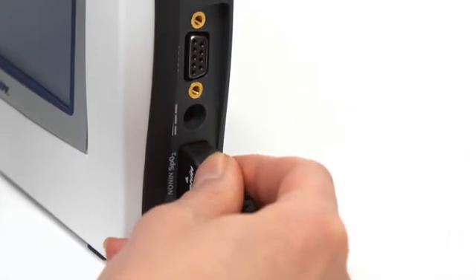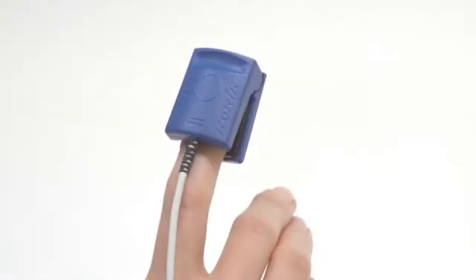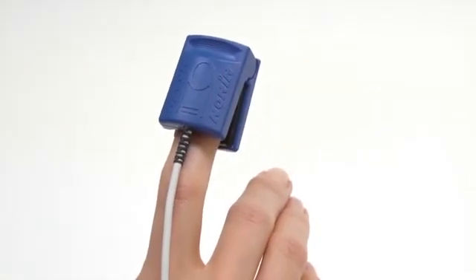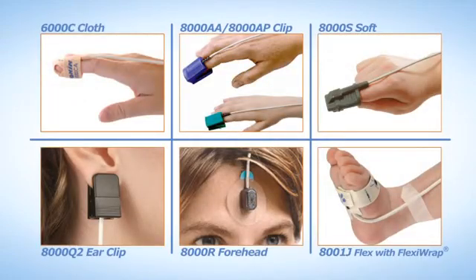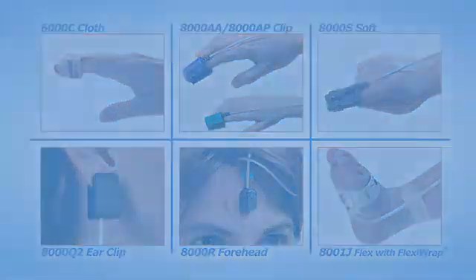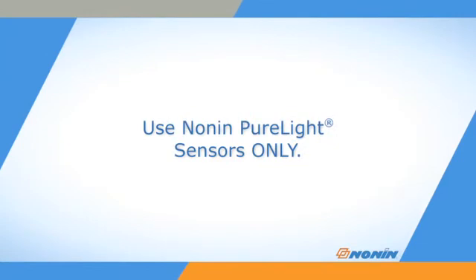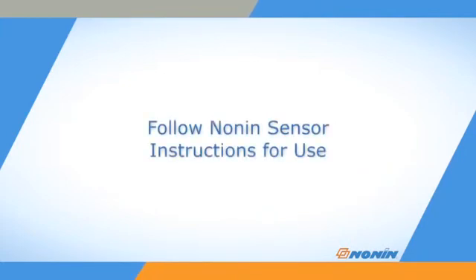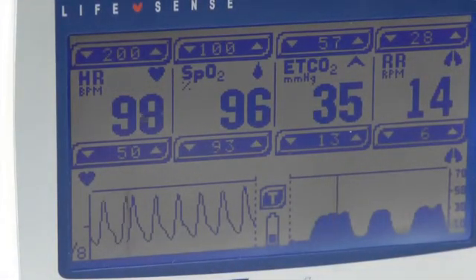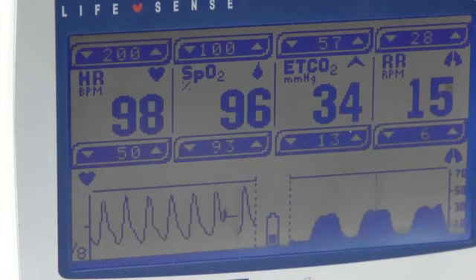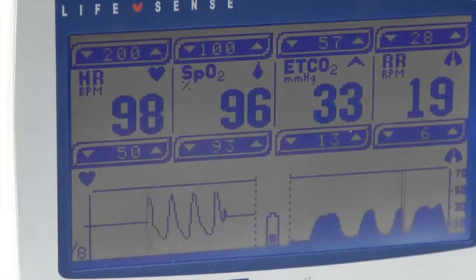The LifeSense Capnography and Pulse Oximetry Monitor has a cable connector on the right side to attach a Nonin PureLight brand SpO2 sensor. The LifeSense monitor is designed for use with Nonin brand sensors only — do not use it with other brand sensors, and follow the sensor instructions for proper placement and care. SpO2 and pulse rate display on the left side of the screen along with the ET-CO2 and respiration data.